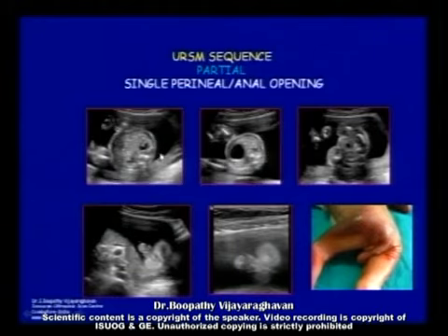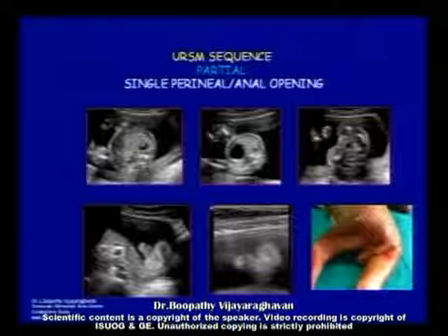Now here there is bilateral hydronephrosis. The bladder looks normal. It even contracts nicely, emptying. But a very important finding is the ambiguous genitalia. And if you go a little behind, you fail to see the anus. So the spectrum is different, varying in partial URSM sequence.